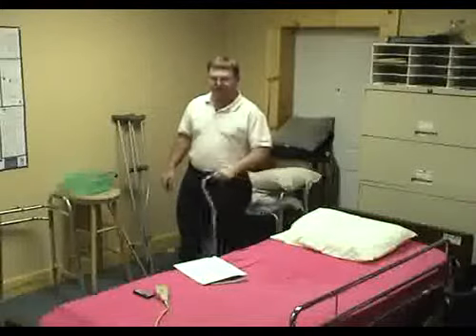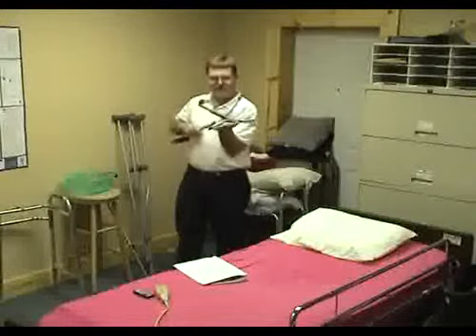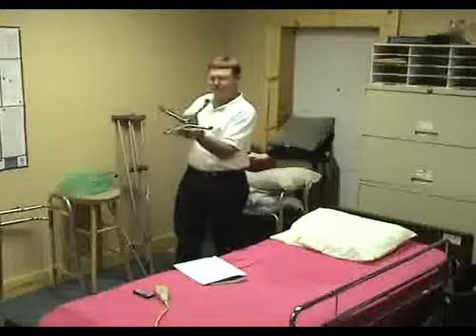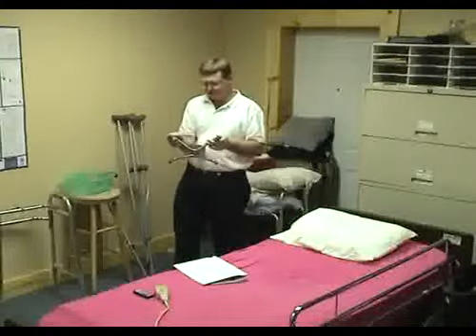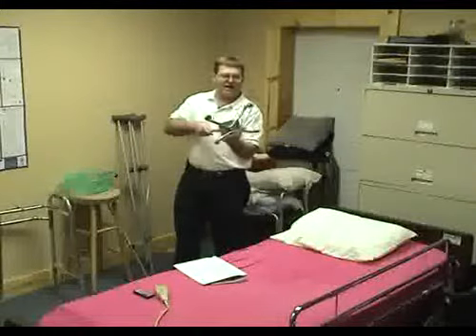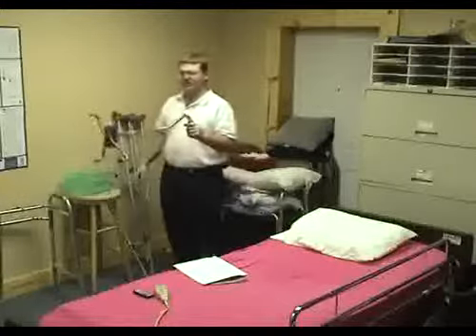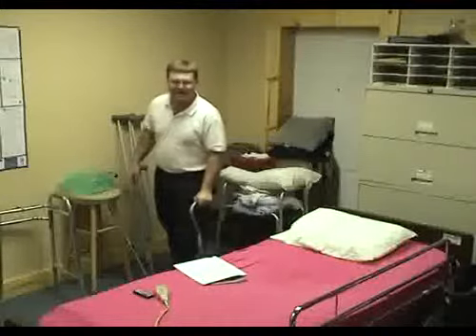This can be used in the left hand or in the right hand. But if you look at the bottom of it, this side here is flat, pretty much, where this side sticks out a lot farther. This is the inside of this cane. So this cane right now is set up for the left hand.